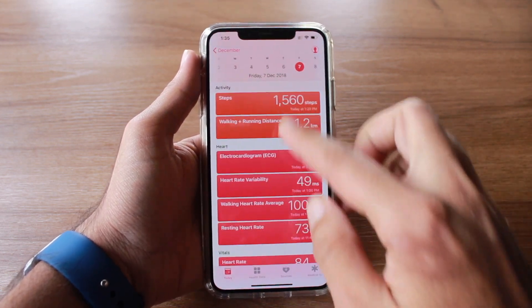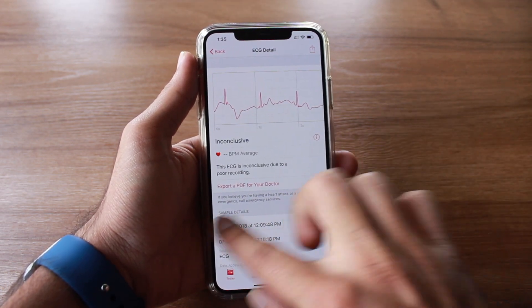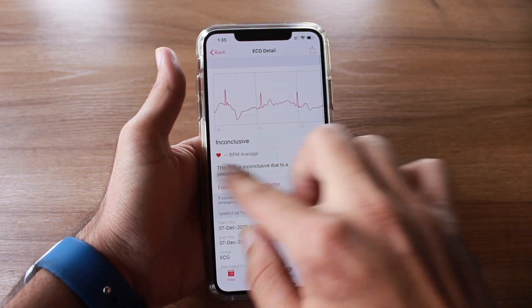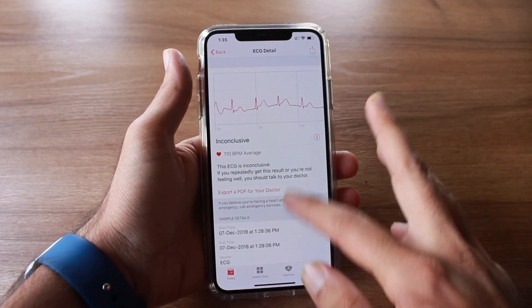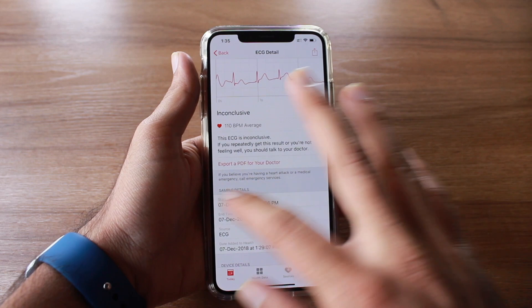I have two readings: one from when the update was installed and the current one. As you can see, both readings are inconclusive. I'm not sure what the problem is — there seems to be a bug. The reading also shows the time and device details.